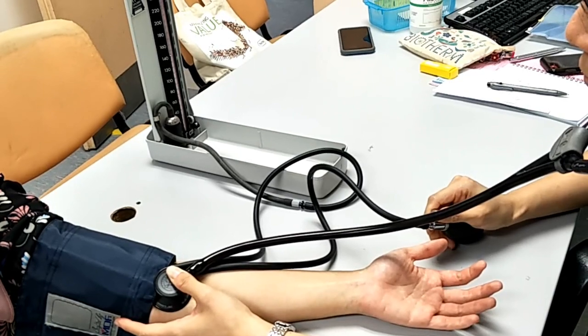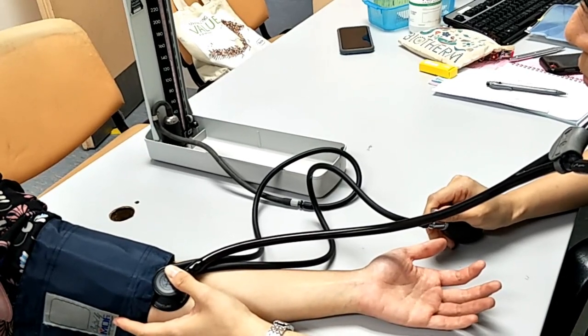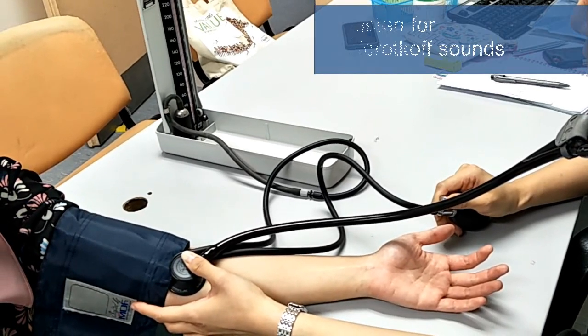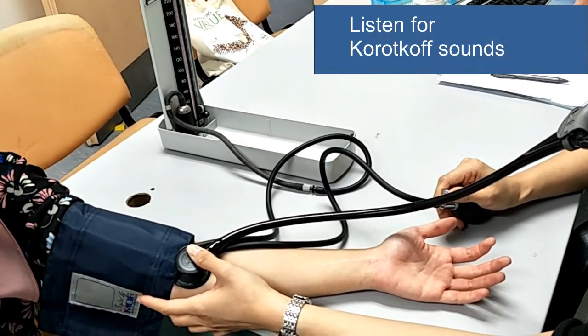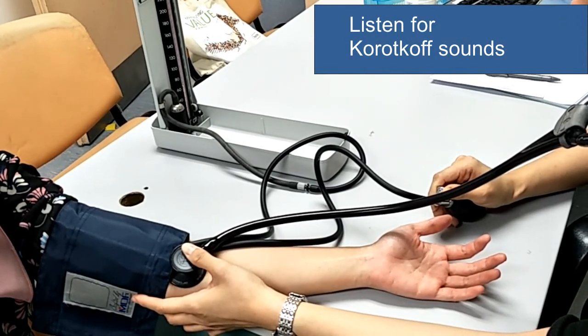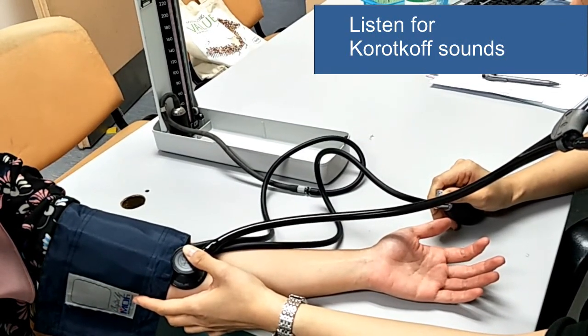Release the air from the cuff at a moderate rate. Listen through your stethoscope and simultaneously observe the mercury gauge or the dial as the cuff is deflated. The first knocking you hear is the start of the Korotkoff sound. That reading you see when you hear the start of the Korotkoff sound denotes the systolic blood pressure.